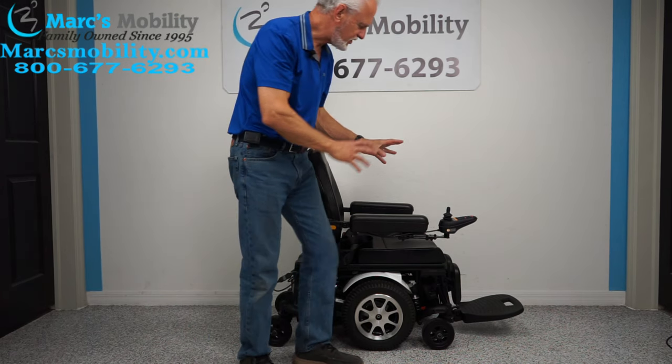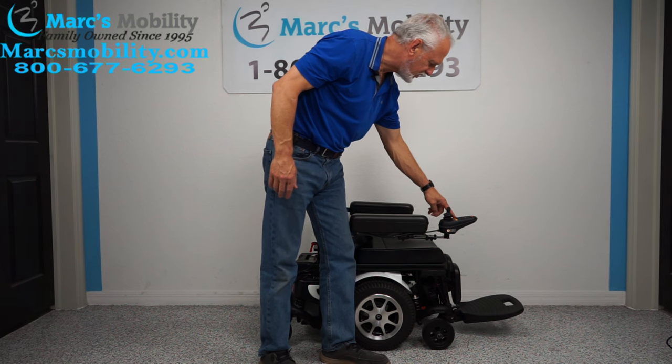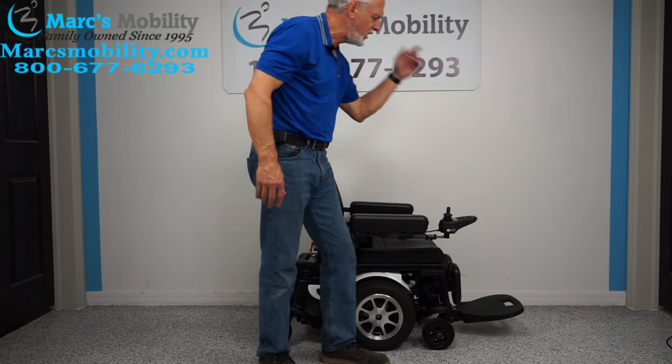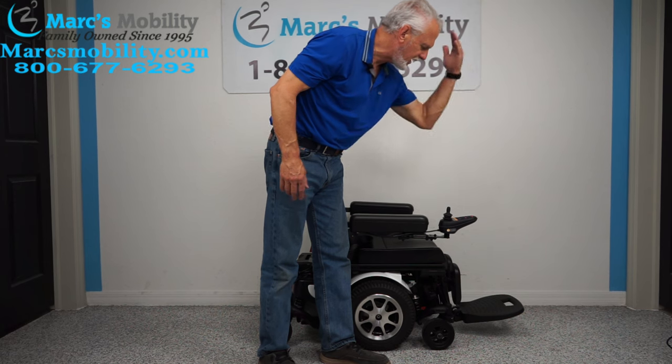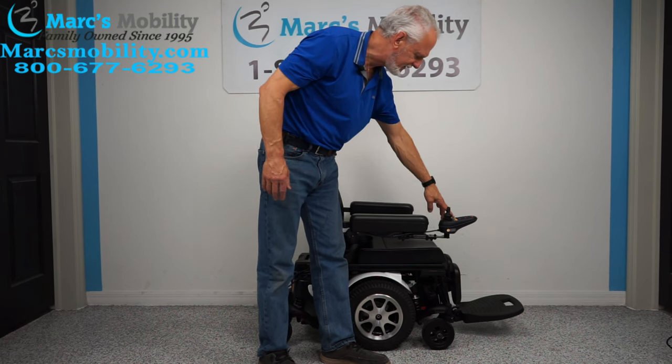If you want the seat to tilt on this chair, you would go to the joystick. On the joystick there are two pictures — a picture of a seat on two different sides of the joystick. If you hit the seat button on the left side, it'll make the seat tilt. If you hit the button on the right side, it'll make the foot plate tilt. I'm going to hit the button on the right side and it lights up.